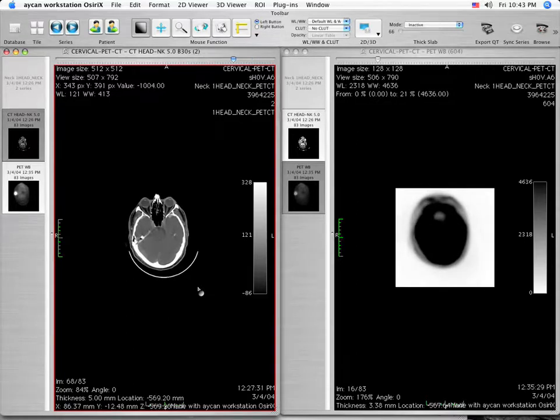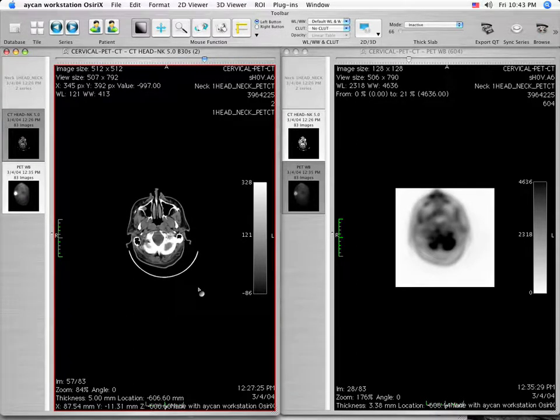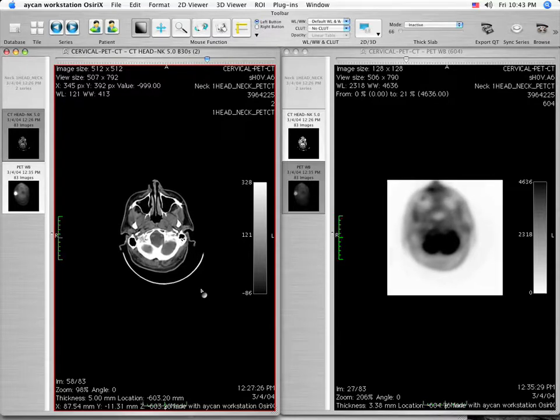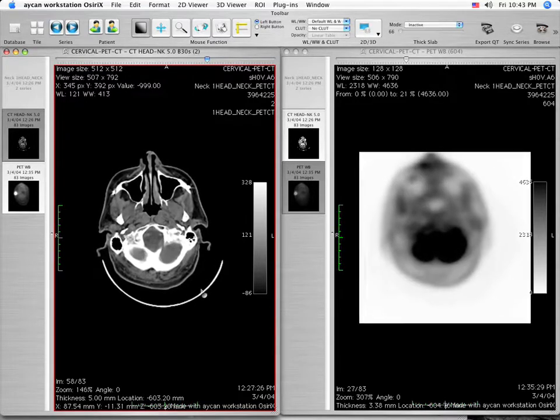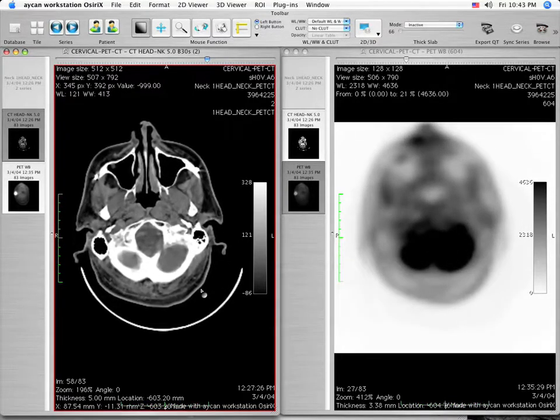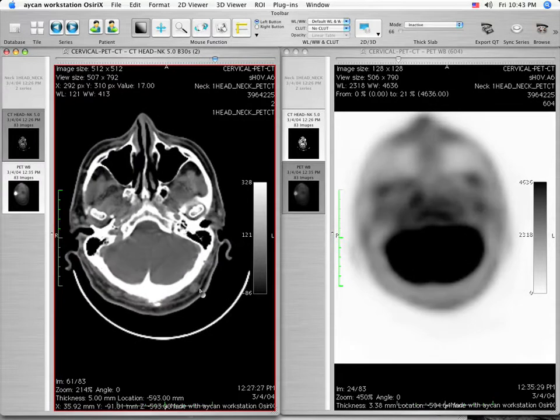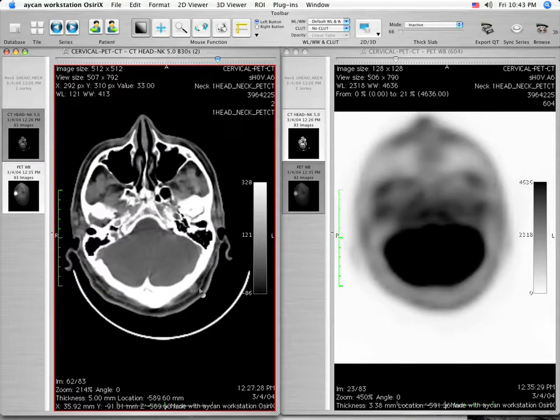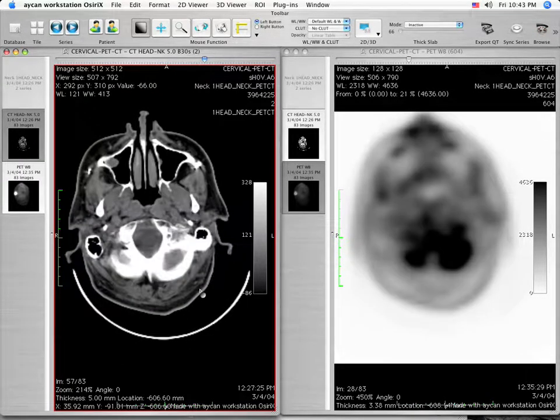Scroll through the images using the mouse scroll wheel. Magnify the image on the screen using the up arrow keys. Note that the series are automatically synchronized so that actions to one series are also applied to the other visible series.